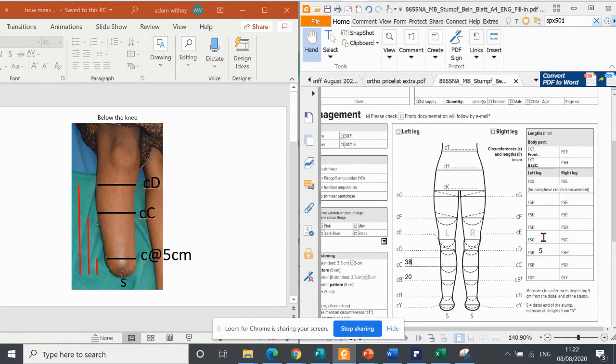So we measure from the stump end to C and let's pretend that in this instance it is 15 centimeters. Then we're left with D, which in this case is going to be the top of the stump shrinker. So we would measure the circumference around D — it's generally a little bit less than C, but not always, so we'll put 37. And we will measure from the end of the stump to D. You see here it says LSD — it's not a drug, it's the length from the stump end to D — and we are going to say that it's 25. And that's as simple as that. The rest of the form is all about the options and things that you want.